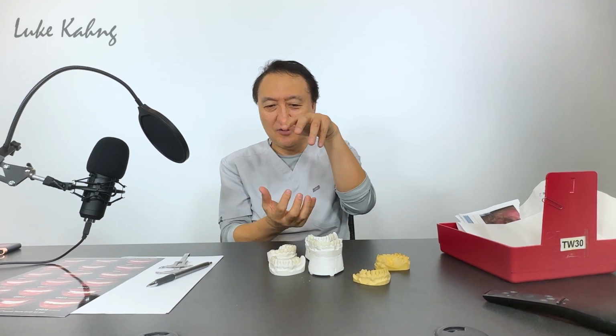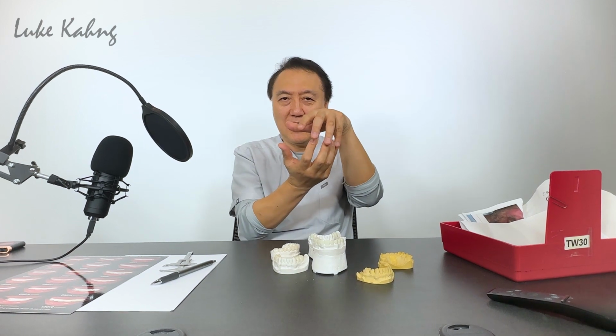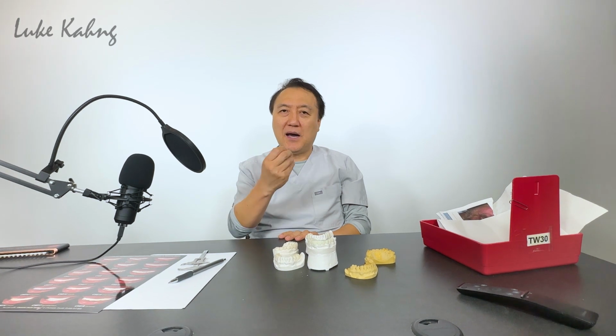I made it. So not only do I check the bite, I checked the excursion, which is canine rise, with no touching on the other side, and protrusion. Then I can decide the incisal edge position, and then move to lateral, which is non-function, and the premolar is non-function, and back to the centric. So that's another way of building the structure for future restoration, not only comfortable, but also giving them as much aesthetics as possible.